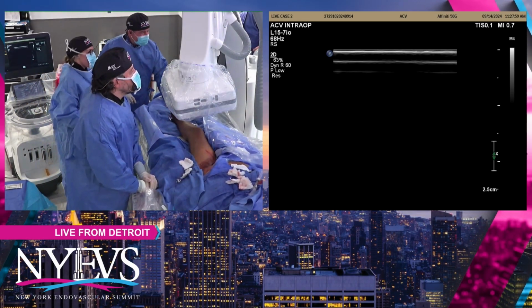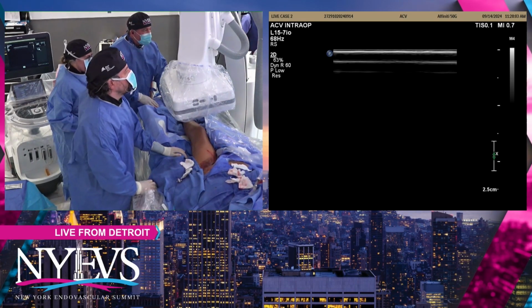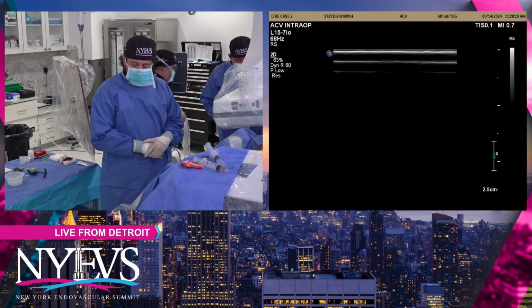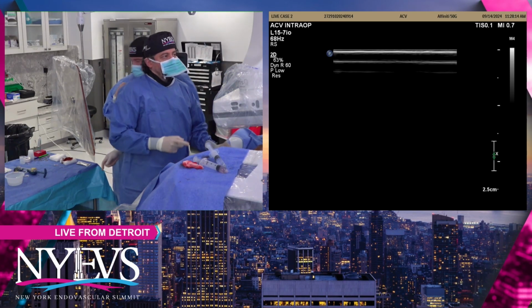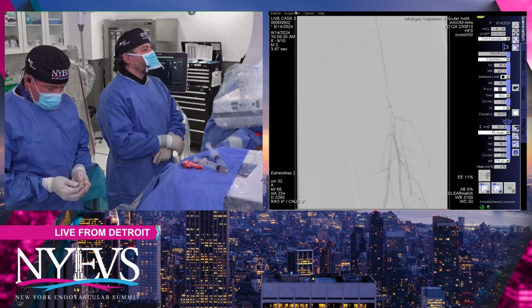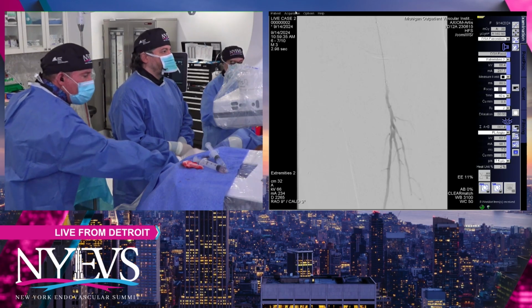So we're going to show you what we have integrated. We already have our wire that crossed back. So I want to show you this last image. Andrew, do you mind coming? I'm coming right here. Do you mind showing us that selective image that we had? This one. So, there are different advantages in my mind for pedal access in this case.